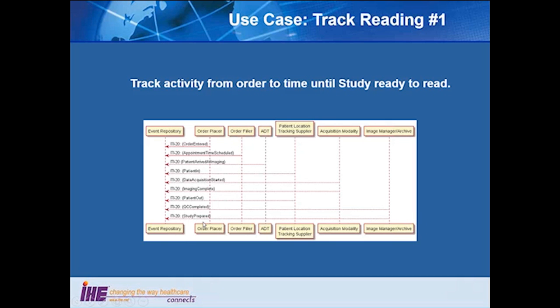This is going to tell you a lot of useful information from the patient arrival and motion. You'll know how long they're spending at each step. You'll know how long the prep time is between when they come into the room and when you can actually start imaging, how long the imaging took, and how long the unprep time was. So if you've got a bottleneck, you can figure out, is it because my modality is too slow? Is it a prep time issue? Is it an exit? Or is it a delay between patients? That makes a big difference in your management of procedures.